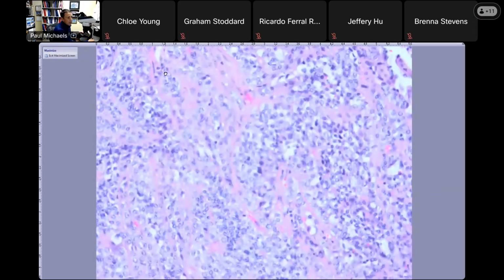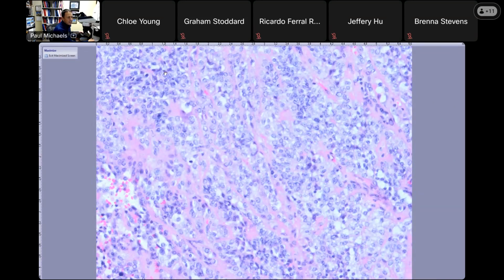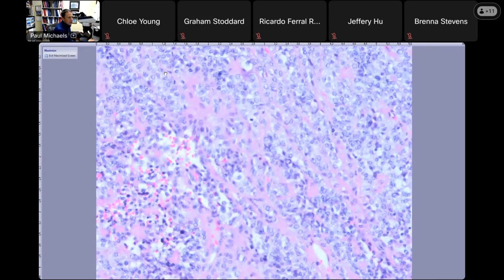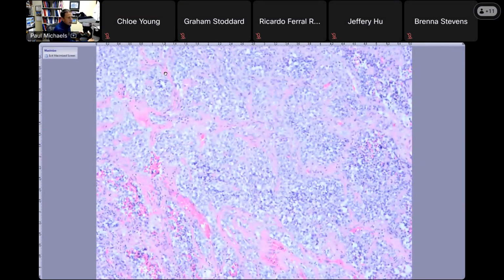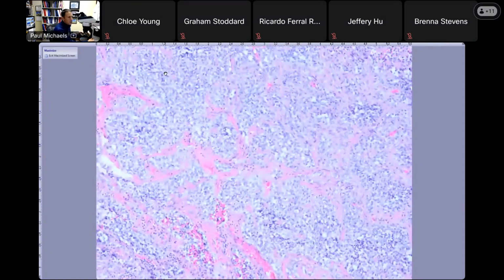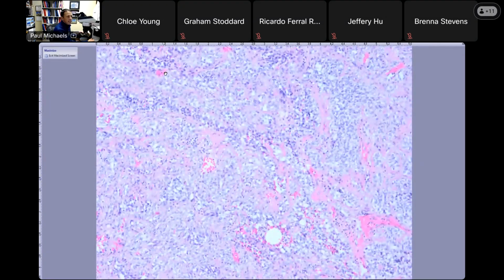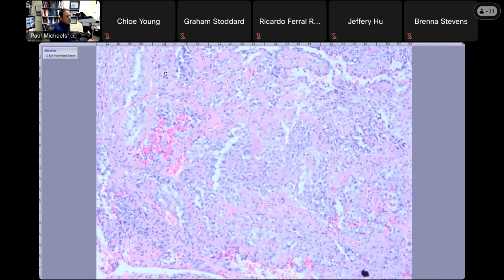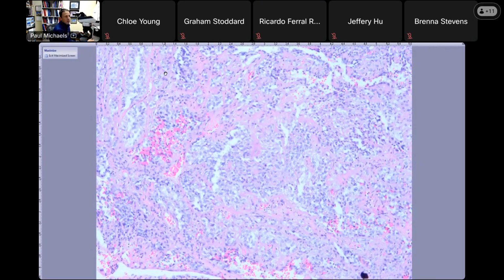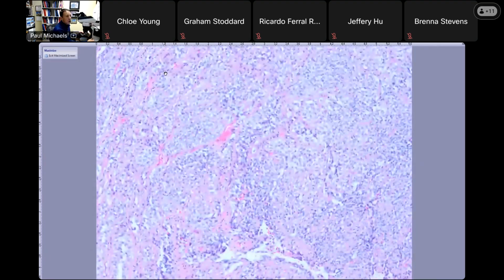So they had no idea what this was. They did a bunch of immunostains. It stained for really nothing. No keratins, nothing, no renal markers, inhibin. We didn't have SF1 at the time. I don't even think it was really used when this was done. Calretinin negative, everything was negative. So they sent it off to Memorial Sloan Kettering. They're like, we don't know if this is benign or malignant. I think I've told you before, there was a really good neuropathologist that I trained under at Mass General, and she used to always say, if you don't know what something is, you don't know whether it's really benign or malignant.